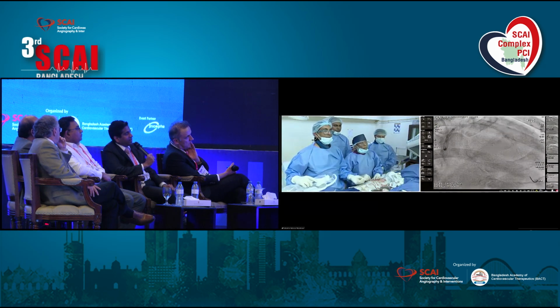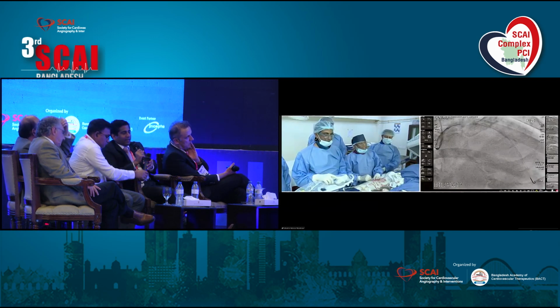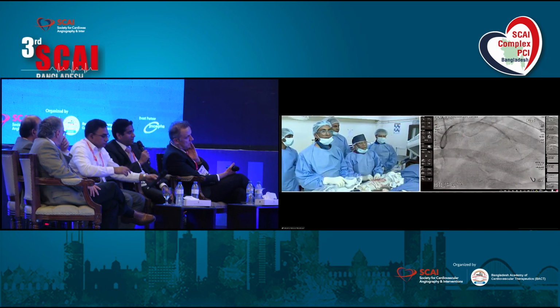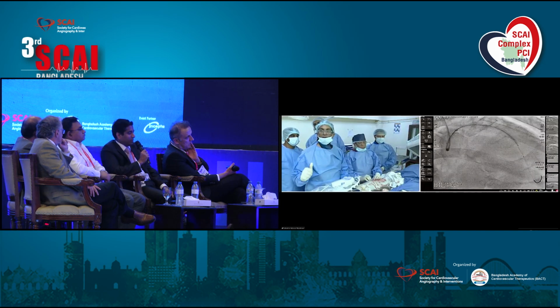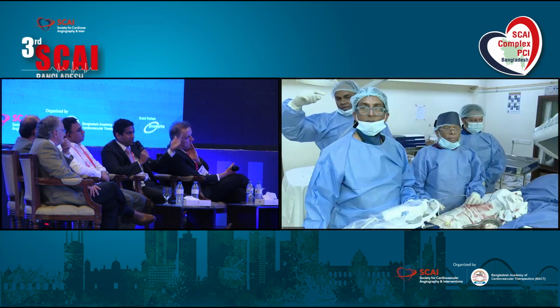I agree. We do agree. Better to be safe than sorry. Yeah, I think media to media is the best way to do it. The only other problem with EEM to EEM, not only perforation, but hematoma. I've seen hematoma happening, and that's like toothpaste. You can't cover it. It just keeps going down.